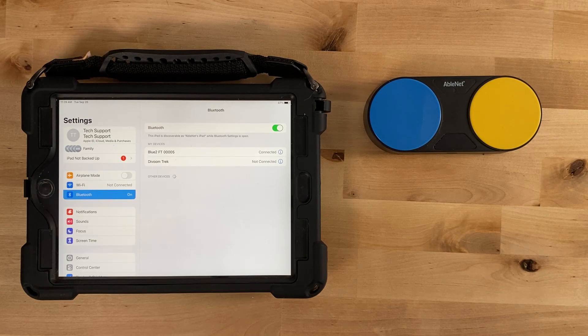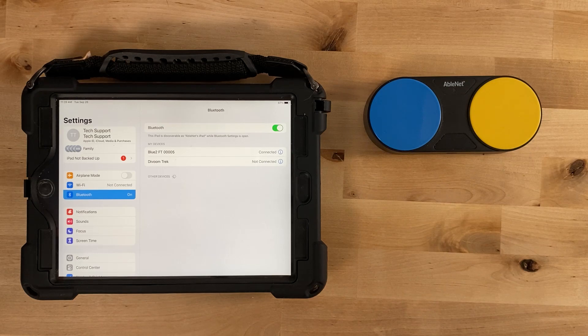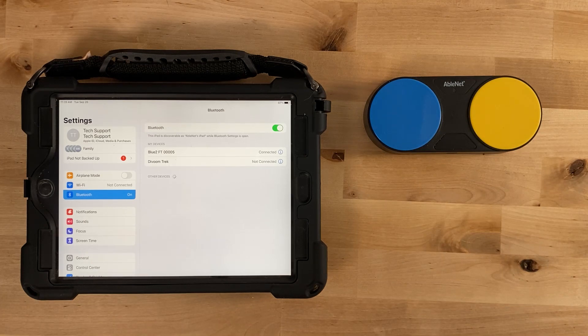The first time you use Bluetooth, the blue switch top, S1, is configured to use the keyboard command SPACE, and the yellow switch top, S2, is configured to use the keyboard command ENTER.